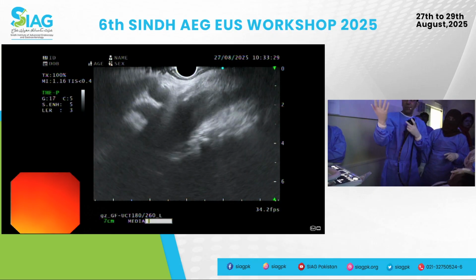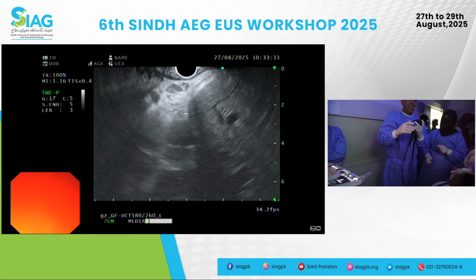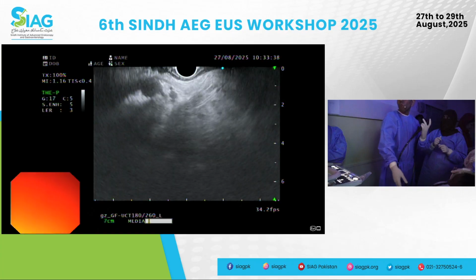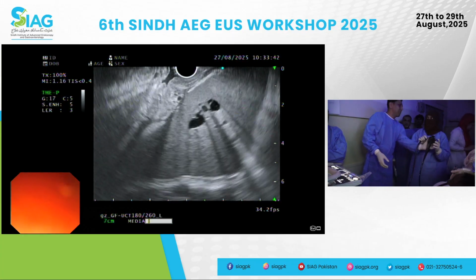relaxed, and even here it's free. My right hand is already free. So you move your shoulders first, because if you move this way you end up already in a bit of a tricky position. Okay, so let's just see if we can go back, let's see if we can reproduce that image.